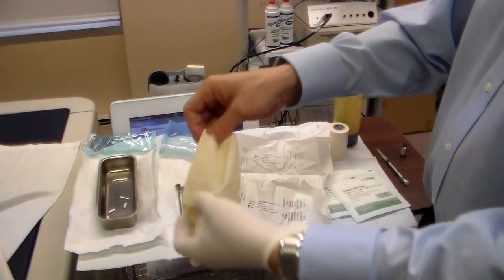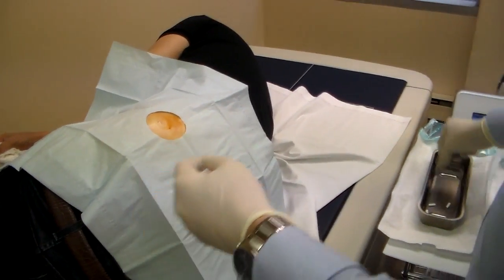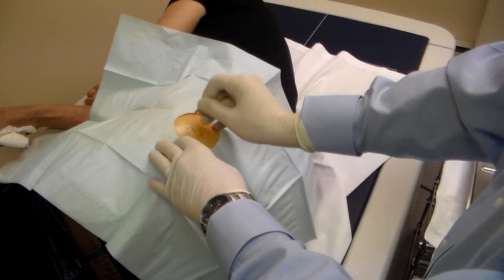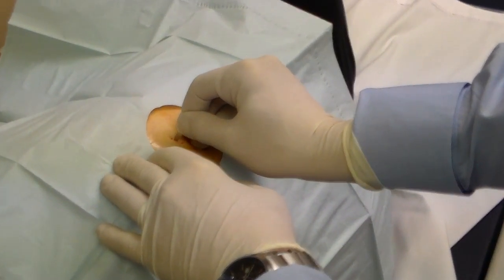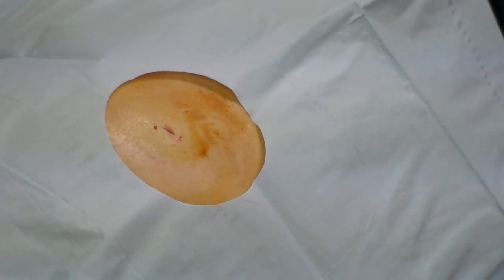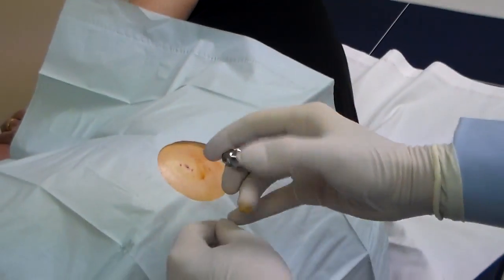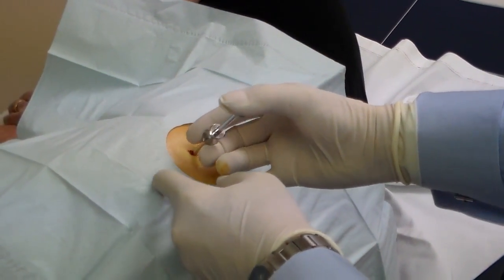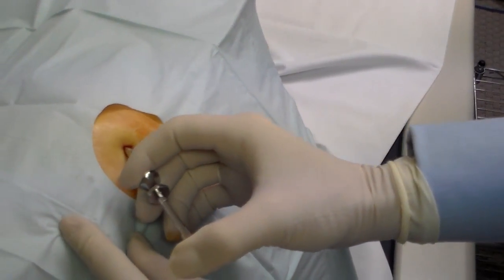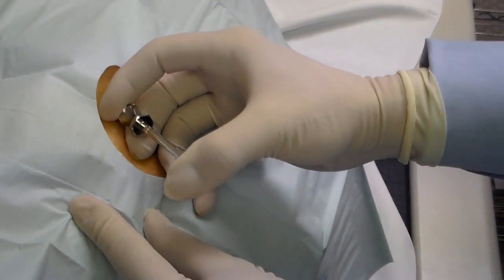The key to the successful procedure is making sure the area is well anesthetized, as well as speed. Studies show that those who complete the procedure most rapidly have the least amount of infection. We take the 11 blade perpendicular to the skin, inserting it about a centimeter down and making an incision no more than half a centimeter in length. We take the trocar, insert the stylet so the bevels meet, go perpendicular to the wound down until we pass the dermis, then angle it at a 30 to 45 degree angle. With a slight pushing motion of the trocar — which takes just a little bit of pressure — it should slide right in.